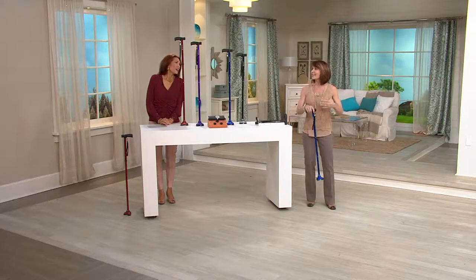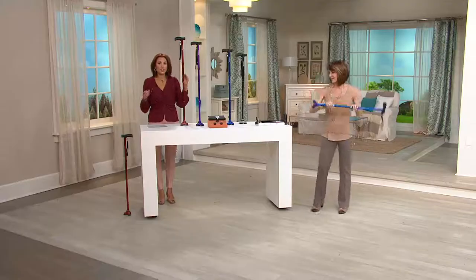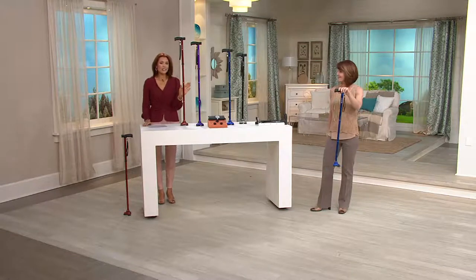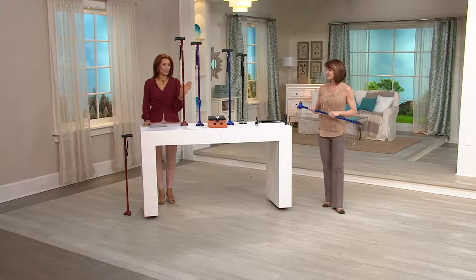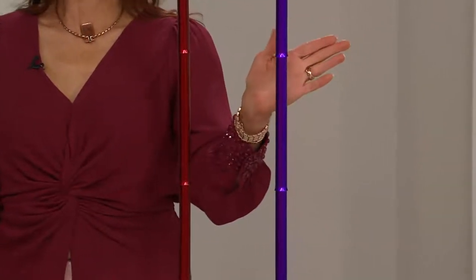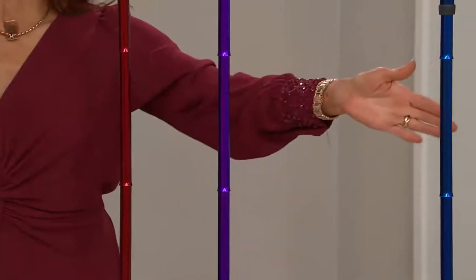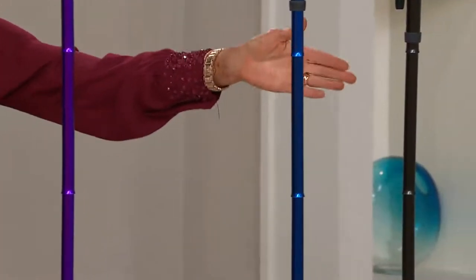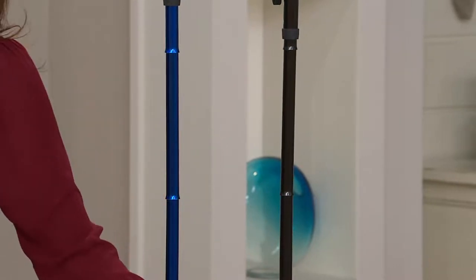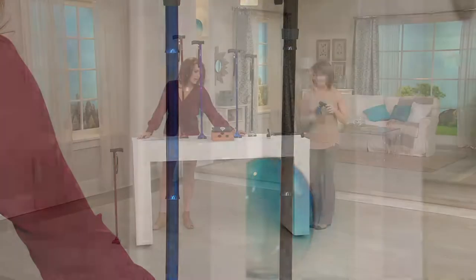You're not adjusting to it — it's adjusting for you. Let me run you through the colors and also talk about the adjustability and the ability to fold down. Here is your red — a beautiful metallic deep red. This one is purple. Blue. And then black — we're calling it silver because the base is silver, so it's a black cane with a silver base, and we're naming it by the base.